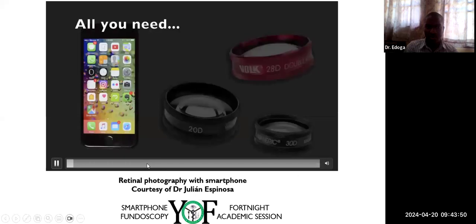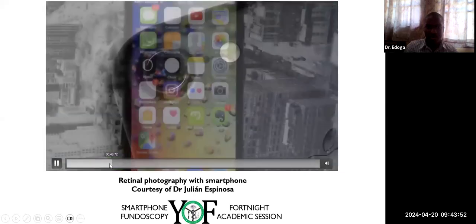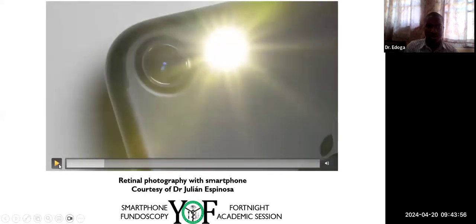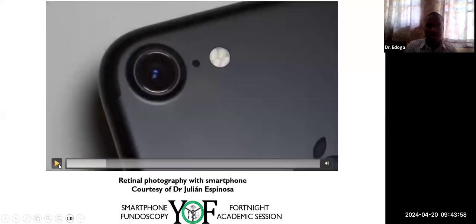A smartphone with a camera. This is just a phone. First, open the camera. I know it works with iPhone 7. Okay, so that's the coaxial thing I was talking about. So this is the camera, and this is the flashlight. So you can see the LED flashlights here.